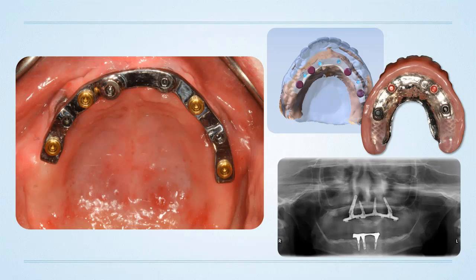On the mandibular arch, some doctors will say, well, Mike, do you do metal reinforcing framework for all of your overdentures? And the answer is absolutely not. It adds cost as well as complexity and also increases the need for prosthetic space. On my mandibular dentures, approximately 98% of the time I do not use a metal framework. Approximately 2% of the time I will. On my maxillary cases, if I am palateless, it's 100% of the time I'll use a metal framework. You just need it because there's a high chance of cracking and fracture if you do not have that metal in there with a palateless denture.